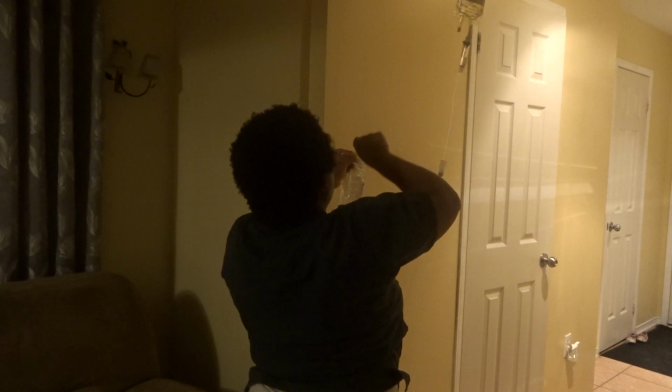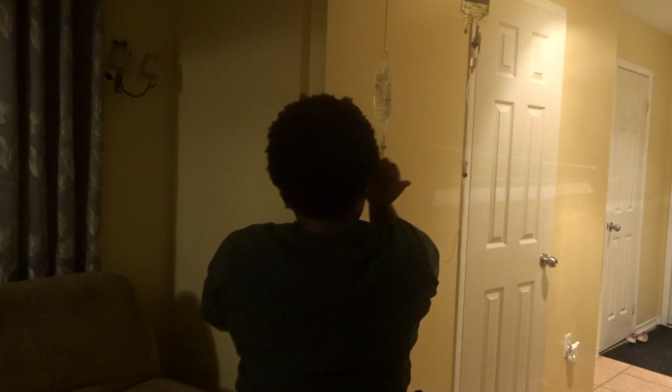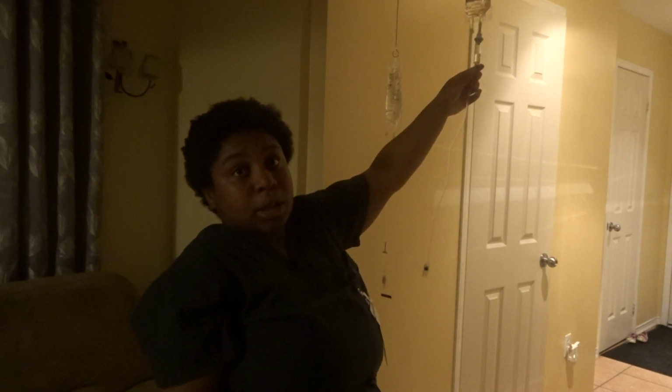So drop the mainline. And then I'm gonna go ahead and I'm gonna open. So you see that my main bag is lower than my medication.